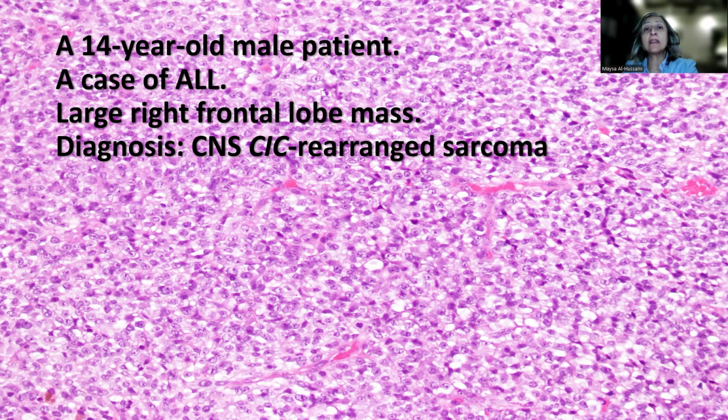Remember that this is among the rare tumors that were recently described, best classified by methylation profiling, but also can be identified by various other methods, including immunohistochemistry, where we find some positivity with CD99. It can be focal, it can be more diffuse, like in our case, coupled with WT1 immunohistochemical positivity, and in places where they have ETV4 immunohistochemistry, it's usually positive. We don't have the stain.